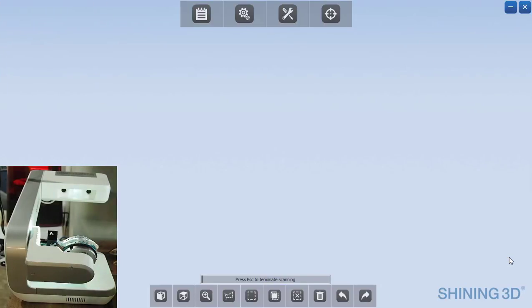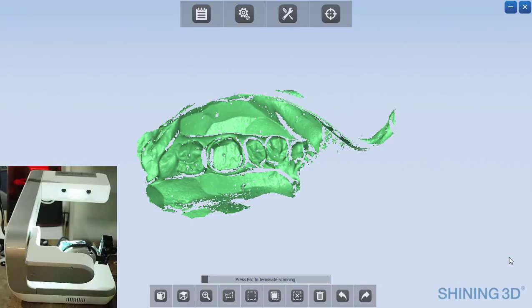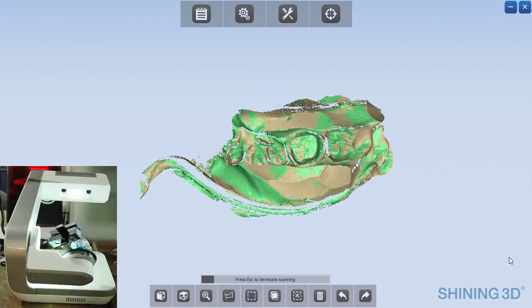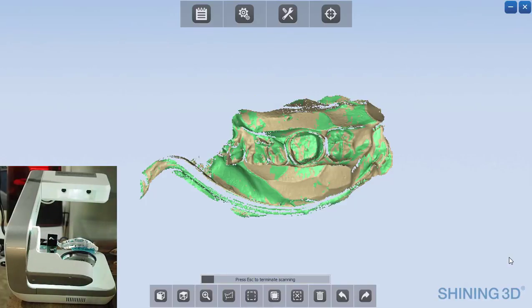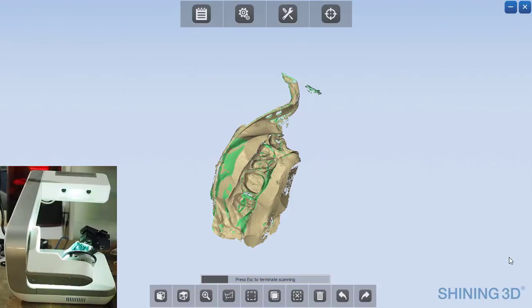And now the software is going to begin scanning and so it shines the light, it'll take pictures for about 4 or 5 seconds, it'll rotate some, take a few more, and each time it's adding more data to this 3D rendering until we have every aspect scanned and it can generate the STL model. So I'll let this finish.